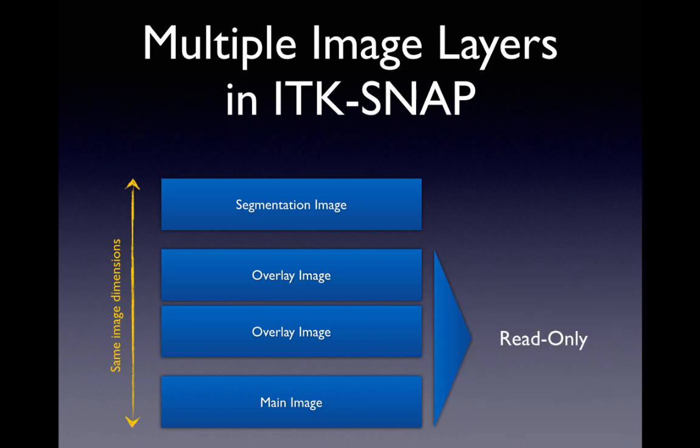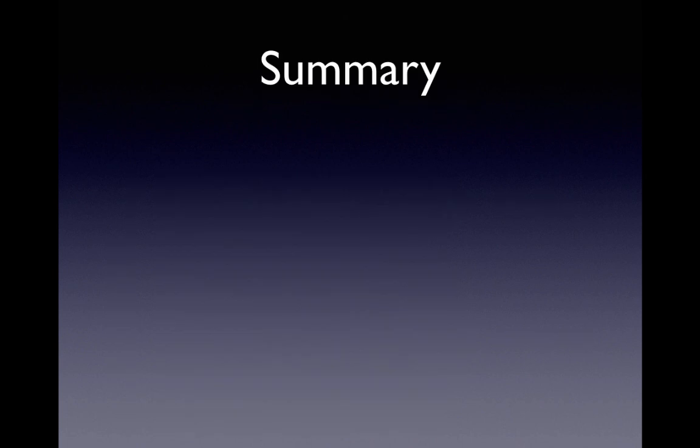And the main image and the overlays are read-only. We never really change them in ITK-SNAP. We view them, but we don't change them. The segmentation image is the image to which we make changes. That's the image that we modify and then save. So that concludes the session.